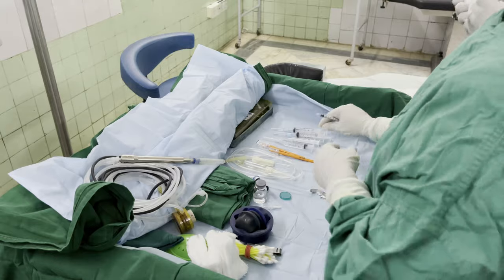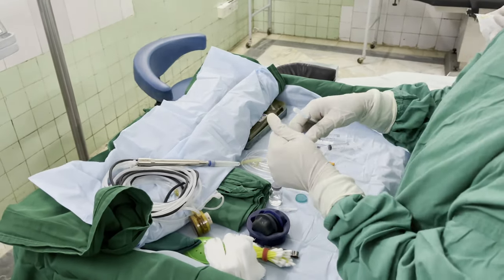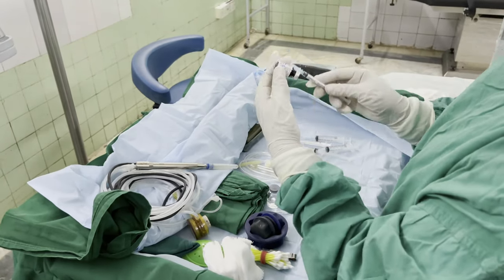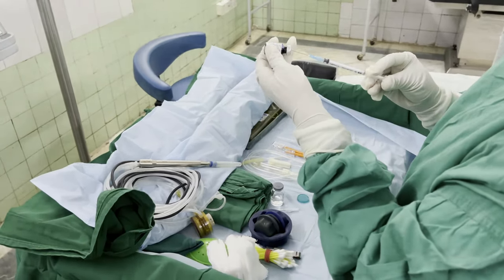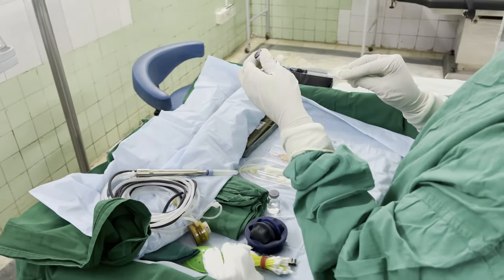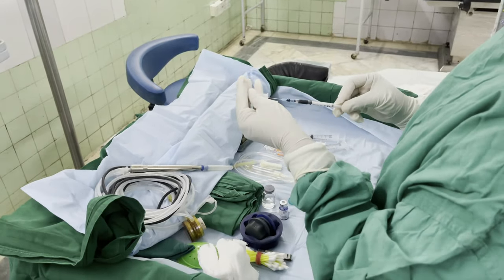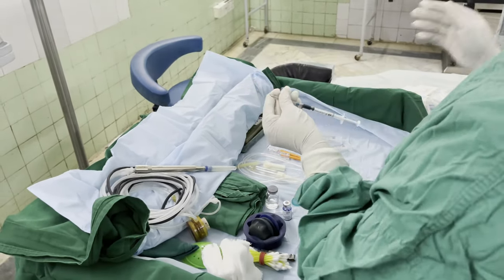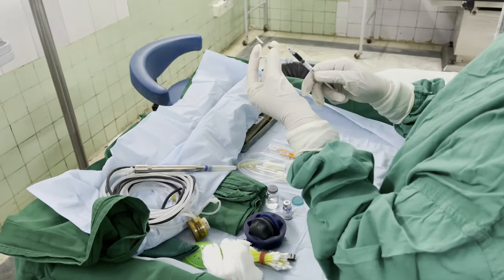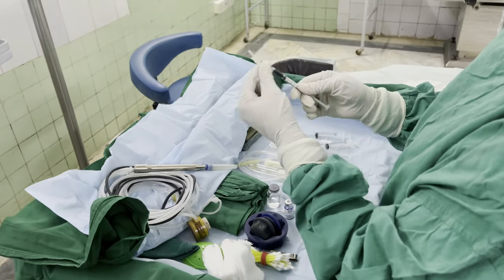So this vial containing blue dye is taken. Again, it is opened. And of course, for multiple cases at the same sitting, sister will draw out and prepare as many syringes as is possible for use in this case, as well as for the rest of the surgeries. We conventionally use blue dye in a tuberculin syringe, and then we connect it to the cannula, and that is also ready for injection.